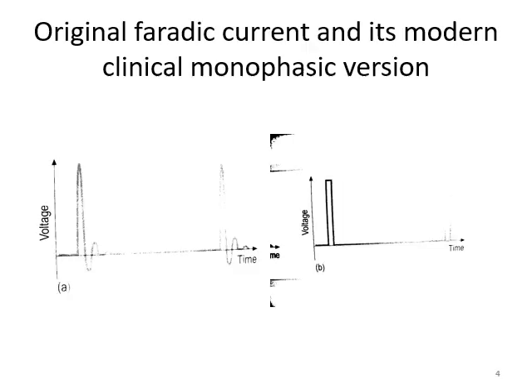On the left side graph, you can see a typical pulse produced by the Faradic coil, and as you can see, the first wave has a very rapidly rising pulse with a very sharp peak, and it is the peculiarity of this sudden rising impulse which results into stimulation of motor nerves and production of muscle contraction.